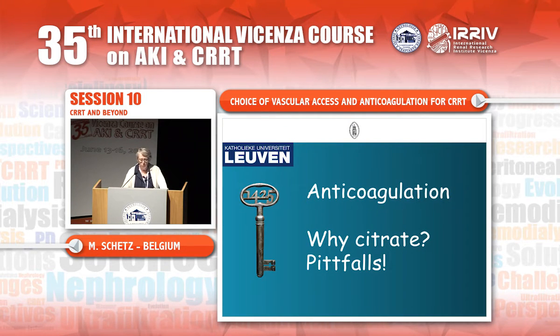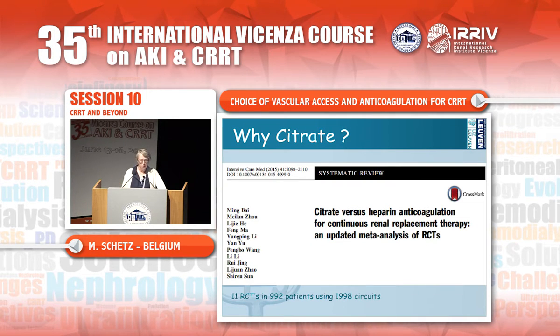Okay, let's now go to anticoagulation. Why should we use citrate? It is recommended by the KDIGO guidelines, also by the French guidelines. And the reason is very simple.